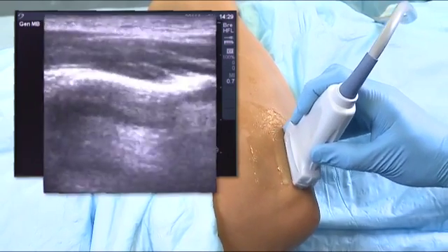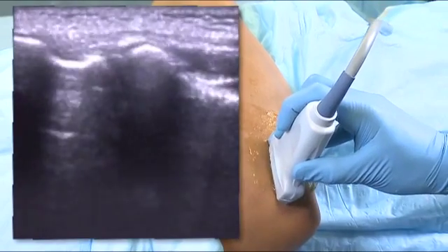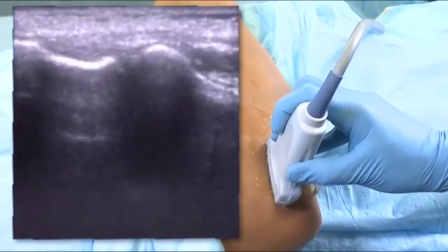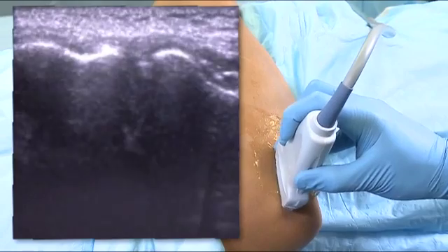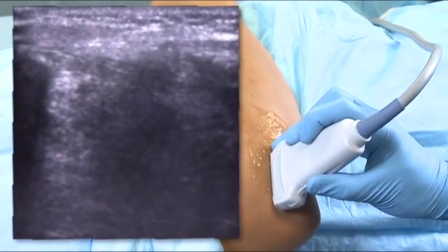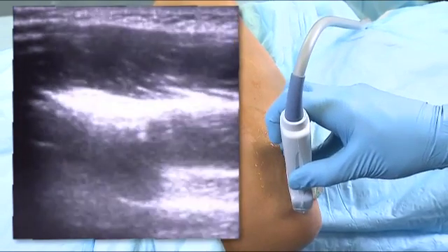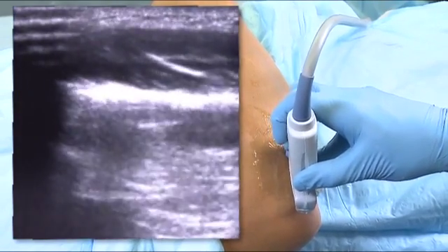As you make it perpendicular, you capture all the appropriate landmarks — radial head and epicondyle. As you can see in this view, if I were to bevel it forward, you lose the bony structures of the epicondyle. If you bevel it in the other fashion, you again just capture a lot of subcutaneous tissue and muscle.